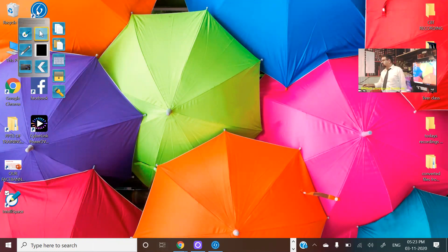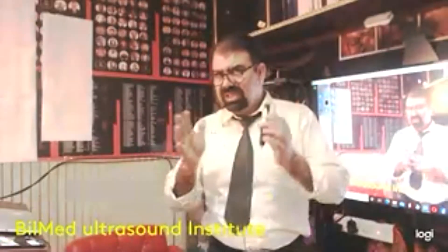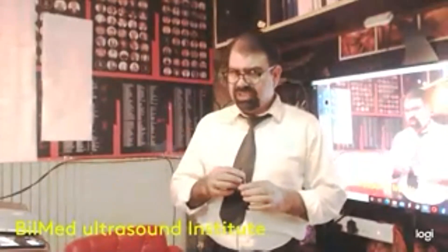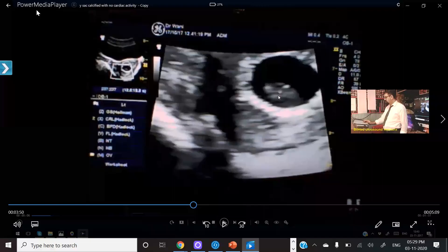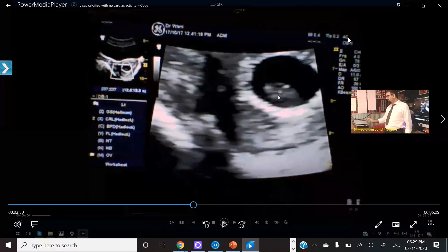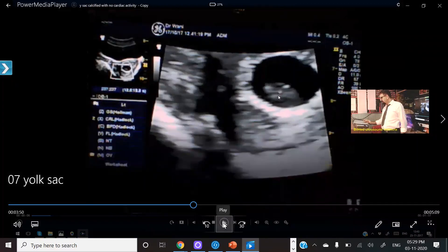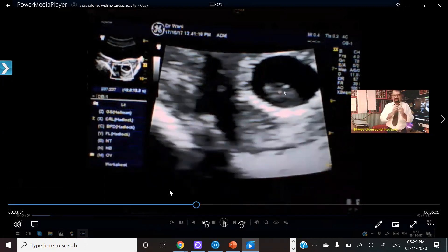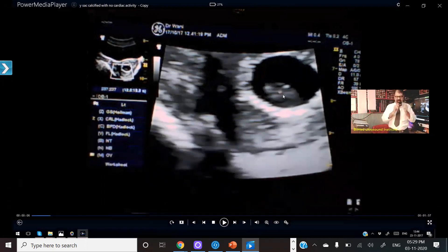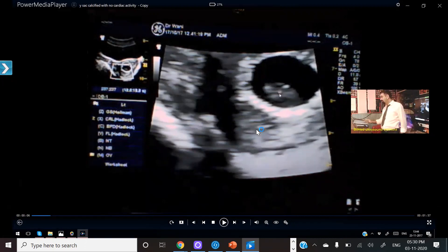Now we will show you some important points from these pictures and see how the yolk sac looks on ultrasound. We will show you some live cases — these are recorded sessions already. What I have to see: I have to see for the diameter, I have to see for the calcification, and first I have to see for the presence — whether the yolk sac is present or absent.